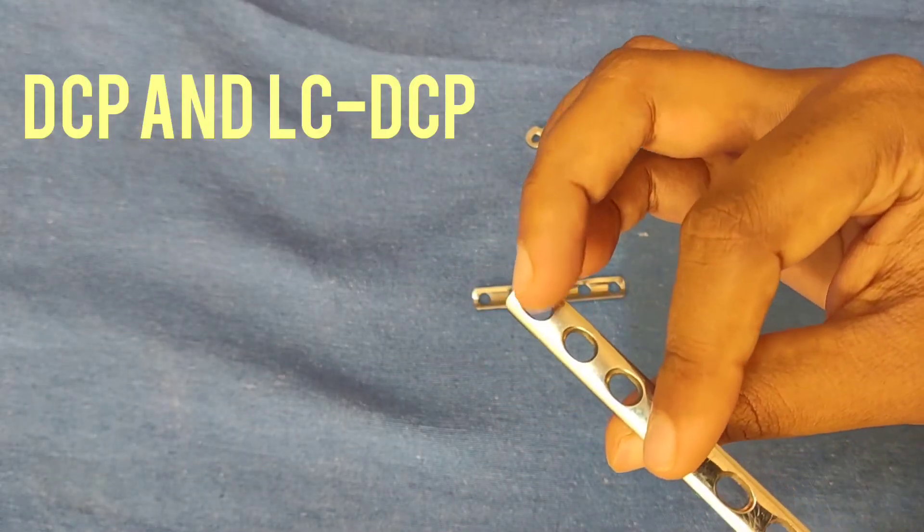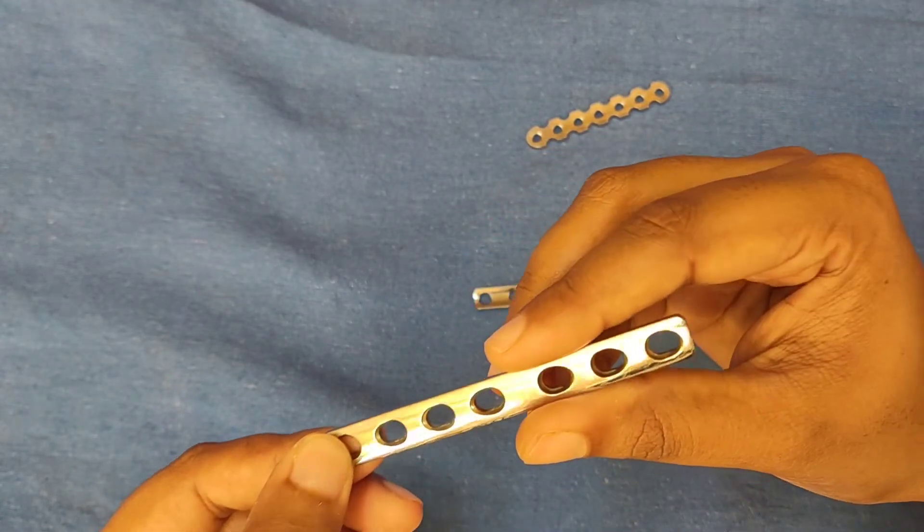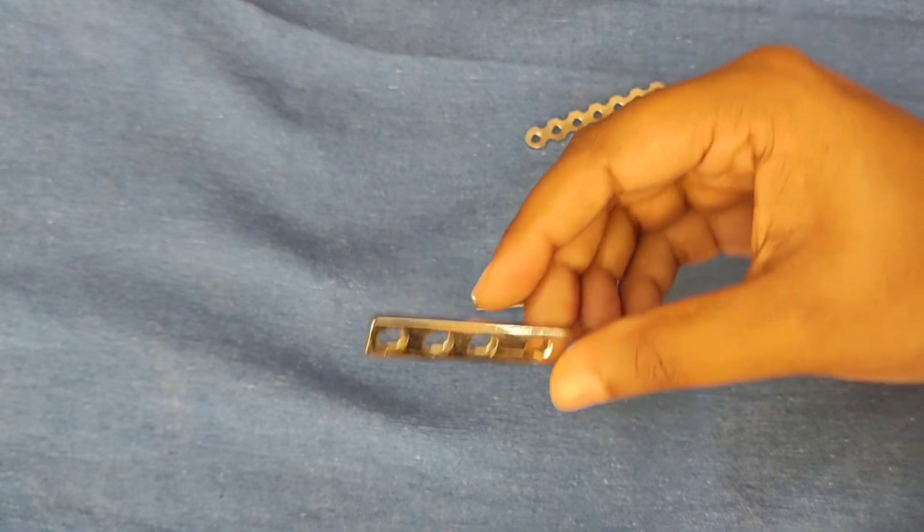Now you can see a dynamic compression plate. In a dynamic compression plate there are no locking holes. Small, narrow and broad DCPs are available.